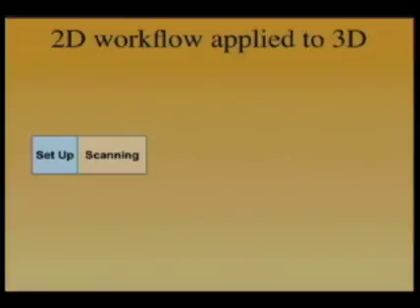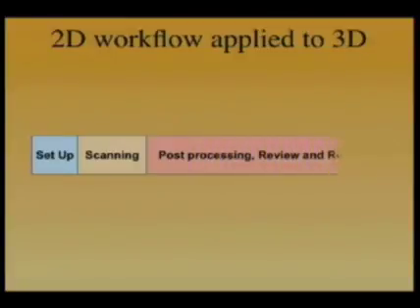You'll notice that the scanning time is shorter than it was with the 2D workflow, because the theory is that you would take the probe and acquire volumes in several areas of interest. That would occur very quickly. You then send the patient on his or her way, and then separately you would take those volumes and post-process them and subsequently review and read them as we do now.